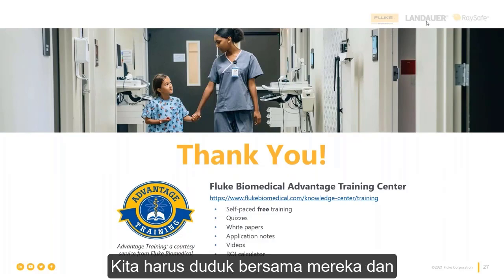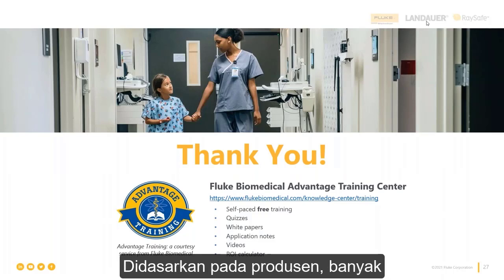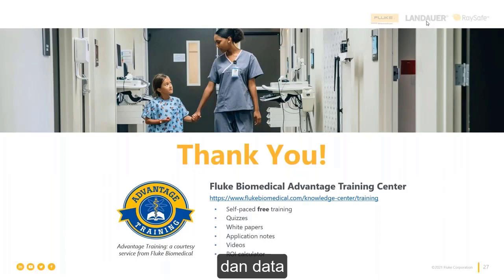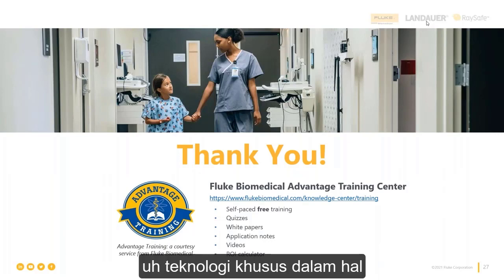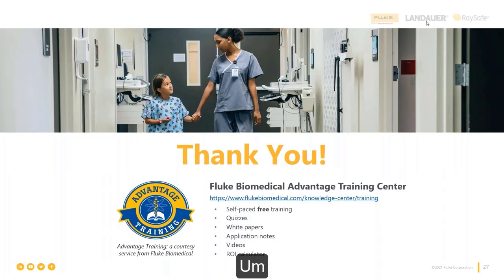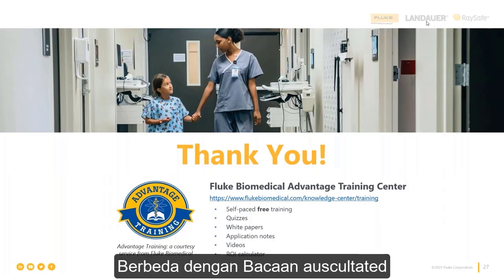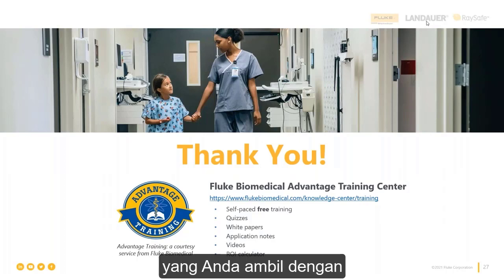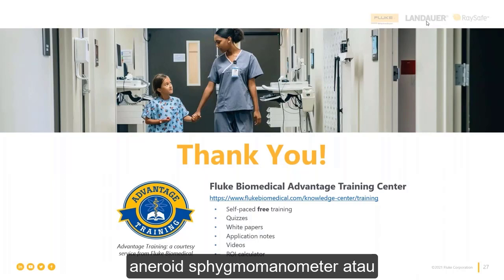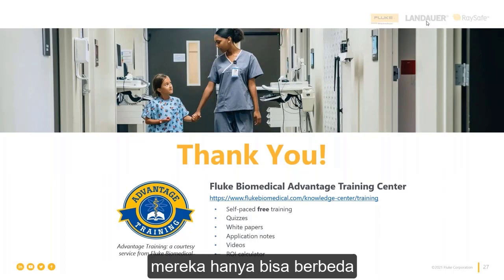Well, we have to sit down with them and explain that the automated NIBP is based on a lot of manufacturer choices and data that is both technology specific in terms of the design and the software algorithm, but also the software algorithm has been customized to the clinical studies that were done by that manufacturer, okay? So it can be different than the auscultated readings that you take with an aneroid sphygmomanometer or a liquid column sphygmomanometer. They can just be different.